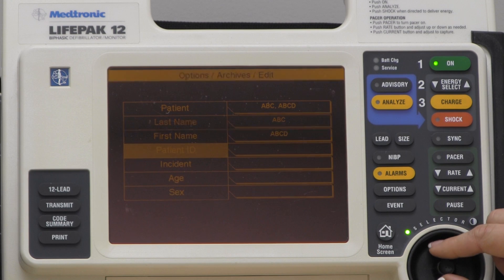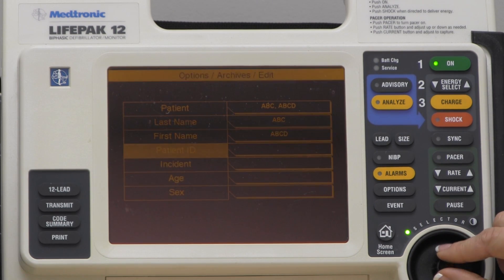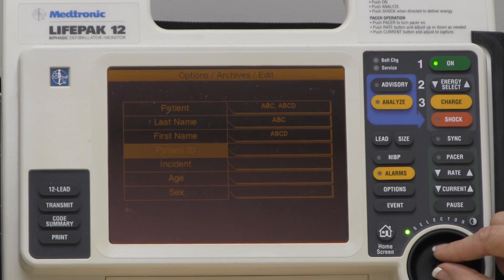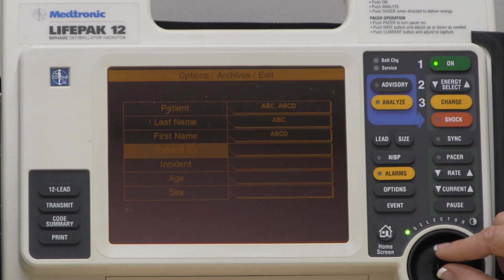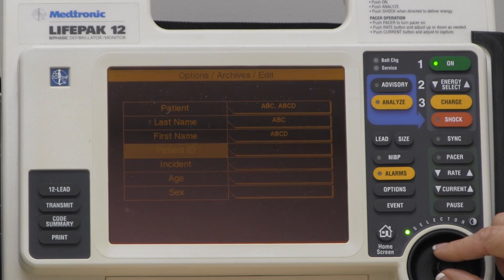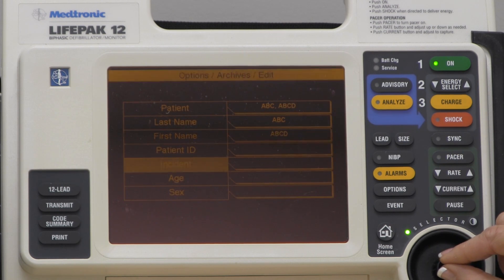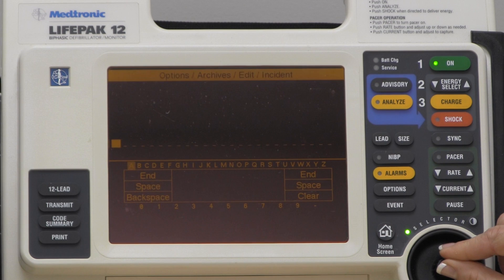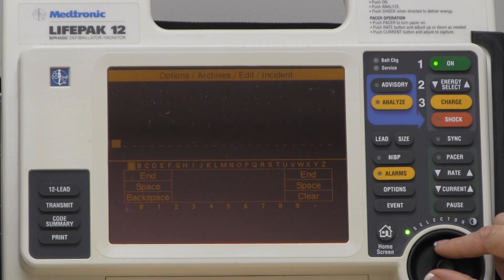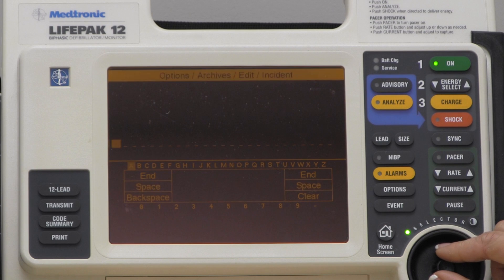If for some reason there is something already placed in the last and first name that's not correct, such as John Doe or Jane Doe, this would only be a rare occurrence, but you could go down to Incident and then put the last name and then the first name in that area.